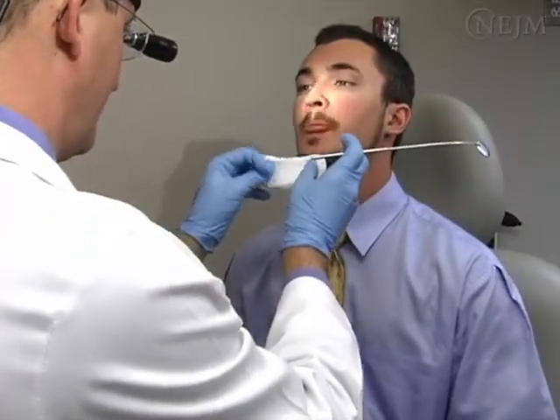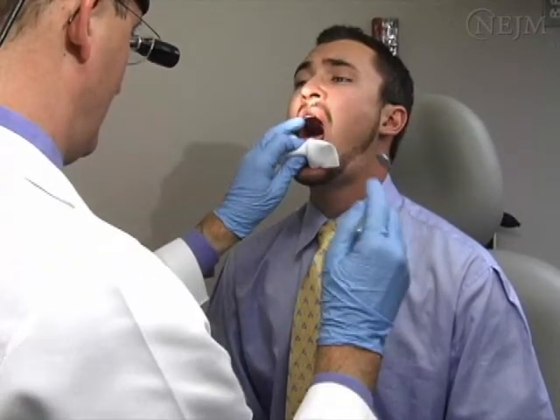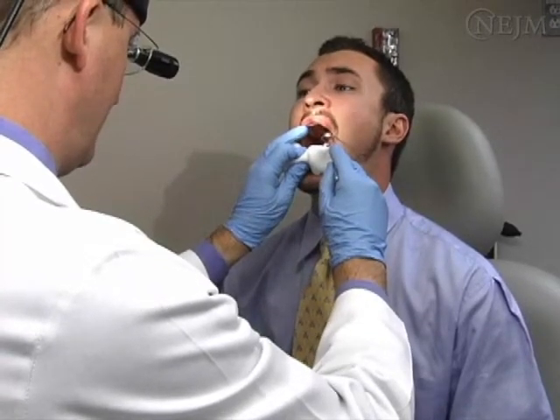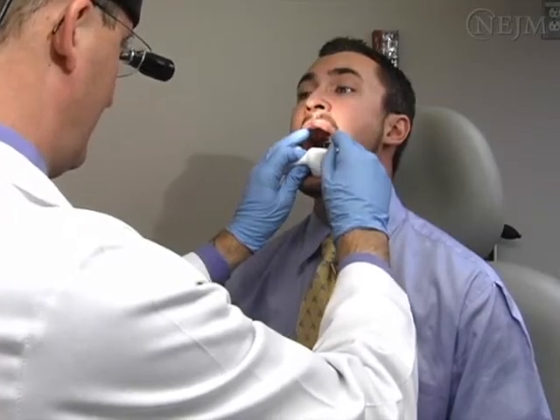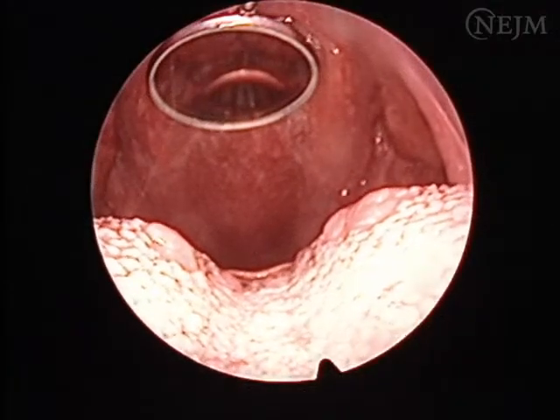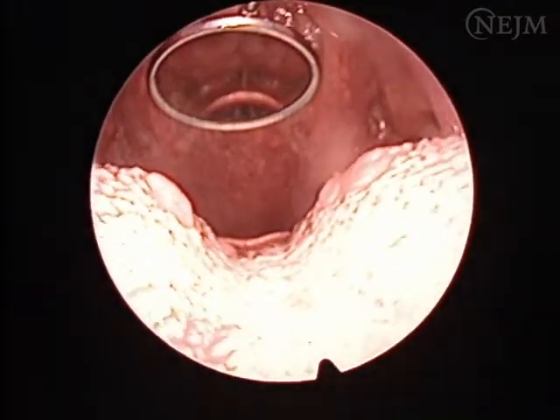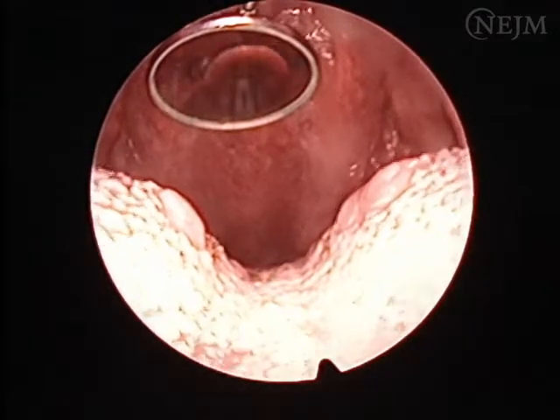Next, gently grab the patient's anterior tongue with a sterile 4x4 cotton gauze pad. Ask the patient to take slow, deep breaths through the mouth. Pass the mirror into the patient's oropharynx without touching any mucosa, then slightly angle the mirror downwards. Visualize the mucosal surfaces of the oropharynx, larynx, and hypopharynx. Ask the patient to say "E" and observe the dynamic motion of the true vocal cords.